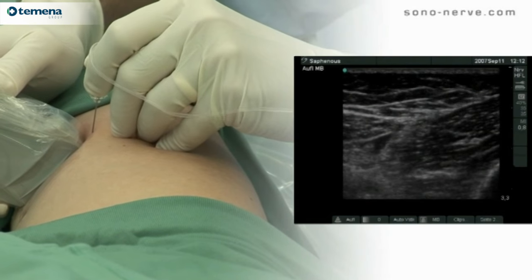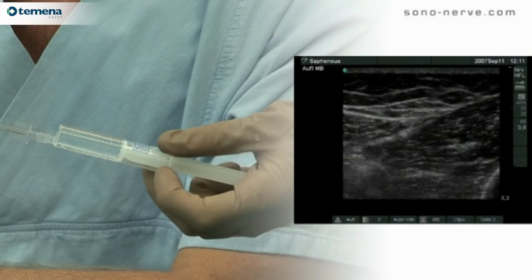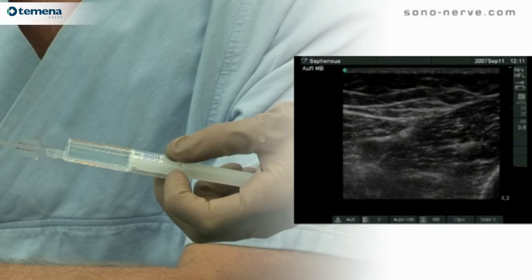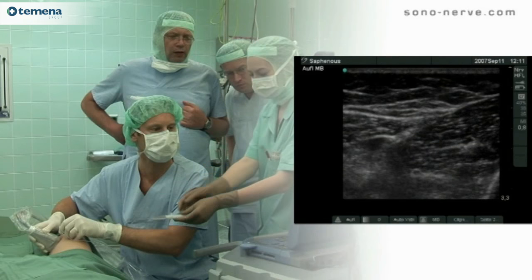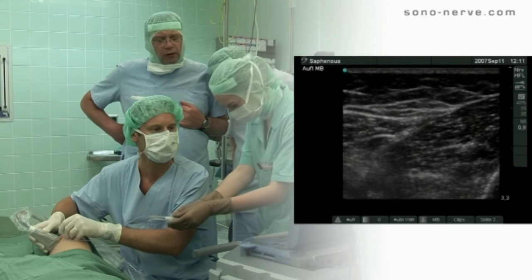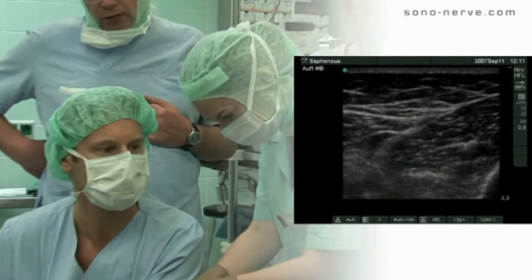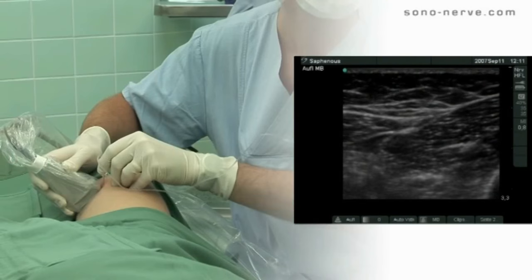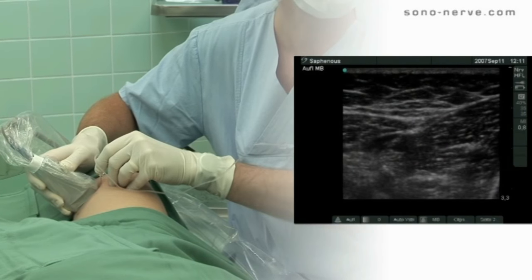The injection is performed by an assistant, which allows the operator to keep both hands holding the probe and needle very still. Regular aspiration helps prevent accidental intravascular injection.